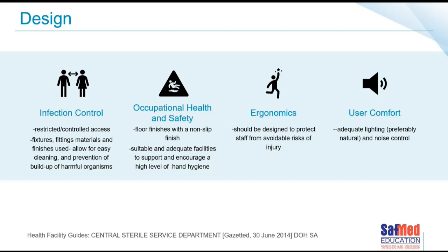I've heard of people asking if they could in fact use what is the word, slate, and the other term for it, granite in the CSSD area because it looks lovely. You can't. Granite absorbs, so it's really not an ideal surface from an infection control perspective in our CSSDs.